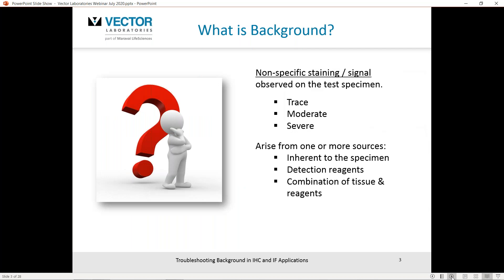So what is it we refer to when we're talking about background? It's non-specific staining or signal observed on the test specimen. This may be observed as a trace or weak staining, possibly as a toning across the section, or maybe just some isolated cells. It may be moderate, and most investigators would probably face either trace or moderate background expression. If they see severe background staining, more than likely there's something fundamentally wrong with the assay setup. The background may come from one or more sources — endogenous or inherent to the tissue specimen, from the detection reagents, or a combination of both.